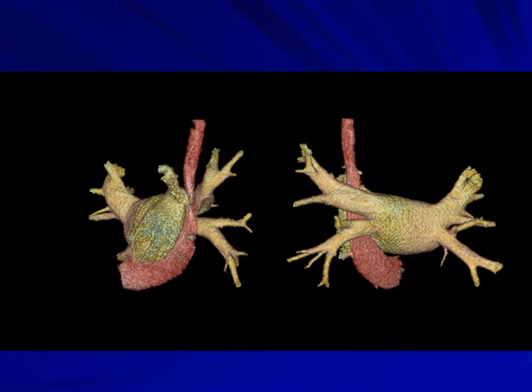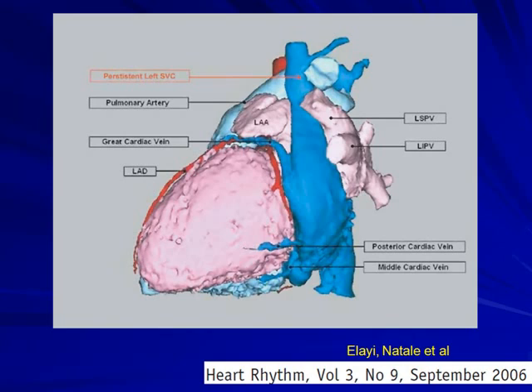Now, why does this really matter? Frankly, if you went through this case, you put a catheter in there to ablate AFib, you go over and ablate the AFib here, you potentially go through this whole case and never actually notice it, unless you advance this far enough up to realize that it was actually doing some things it's not supposed to.